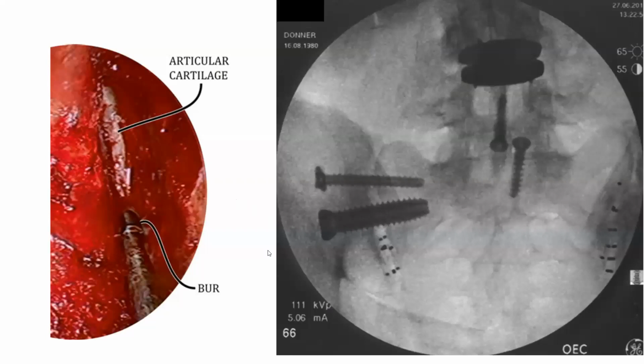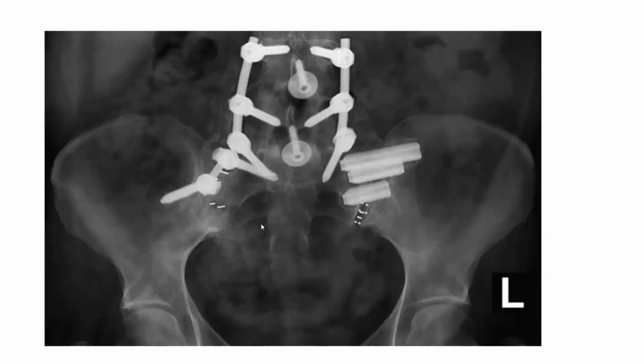This can be done with any of the devices that are out there, manufactured that actually are primarily transfixation devices between the ilium and the sacrum, versus a true SI arthrodesis, which I believe is the main purpose of performing an SI fusion, not a fixation, but a fusion, and the posterior inferior approach allows for this. Again, this is what it could look like. When you obtain the right type of arthrodesis, you can see that joint is eliminated, and I predict that if there's no joint, then it's hard to have pain from a structure that's been obliterated and fused.